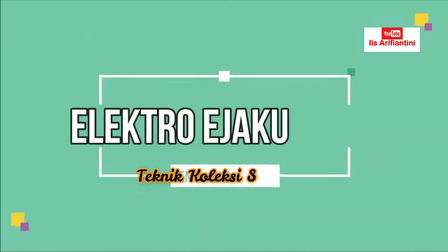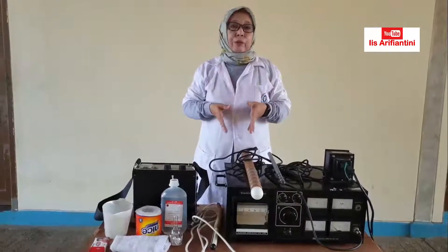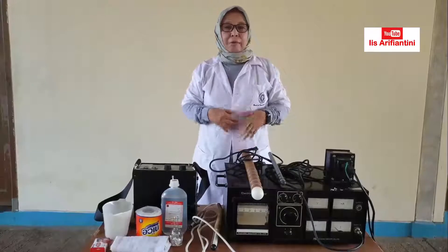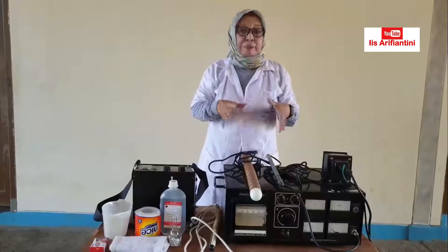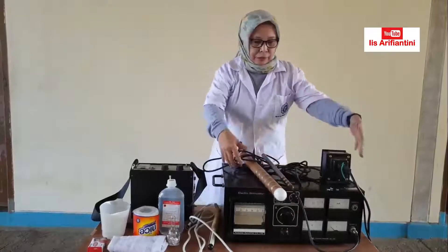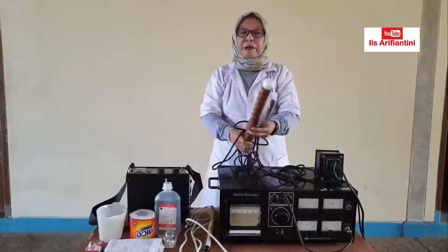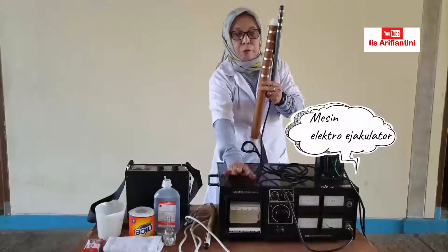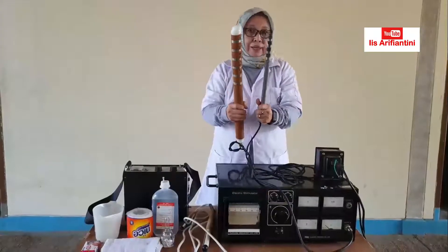Hari ini kita akan mencoba mendemonstrasikan cara menampung semen dengan elektro ejakulator. Elektro ejakulator adalah alat untuk menampung semen yang sebenarnya digunakan untuk hewan liar, tapi untuk praktikum ini kita akan menggunakan hewan ternak. Elektro ejakulator ada beberapa macam tipe. Yang kita miliki di IPB ada dua tipe — ini adalah tipe buatan Jepang. Ini adalah mesinnya untuk memvoltasekan rangsangan listriknya, dan ini adalah probenya yang dimasukkan ke dalam rektumnya.